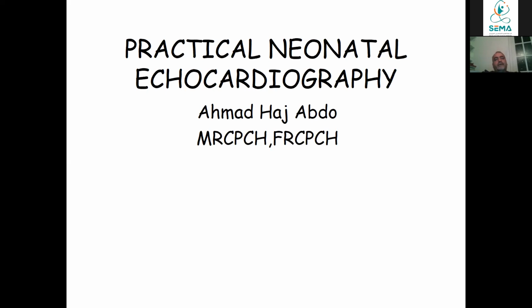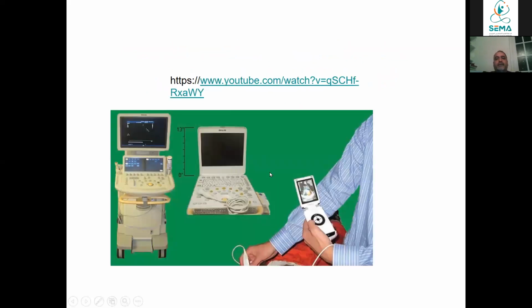especially for ductus-dependent lesions, or for cases where you want to start treating pulmonary hypertension, or you want to start treatment for PDA. I will start speaking about the basics of echocardiography, but it's basic.